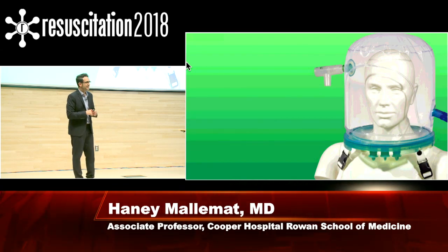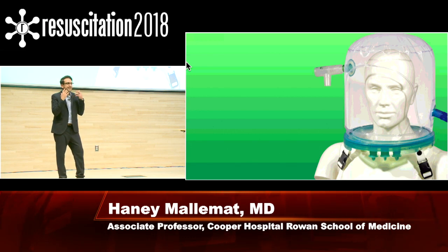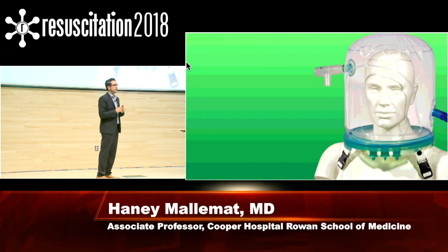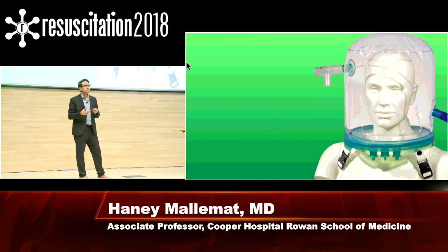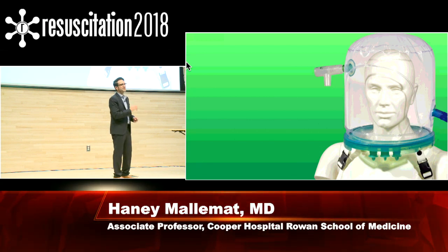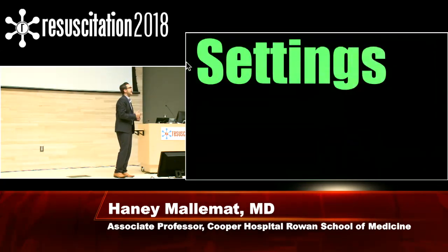This is the thing. The CPAP hood. No pressure on any point, just on the neck, and this creates a positive pressure environment so their nose and their oropharynx can get oxygen. I think this thing is fantastic because, again, it doesn't provide pressure on the septum. Patients tolerate it very well. They can take breaks and eat some food every once in a while, talk to their families. But my personal favorite reason for why I like this is that anytime I have a patient that's asking a lot of questions, I can just zip it back up. Mr. Smith, it's time for some therapy again. Exit stage left.